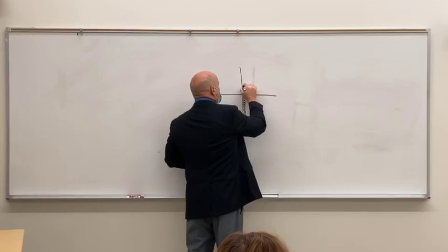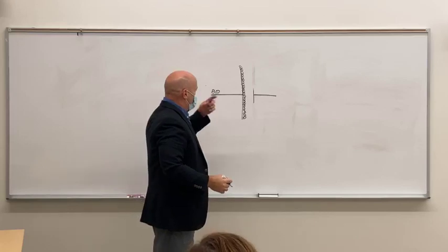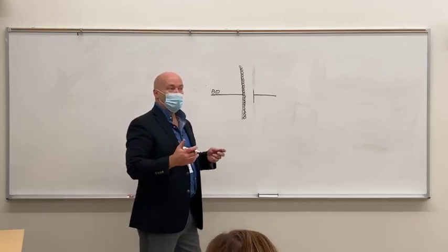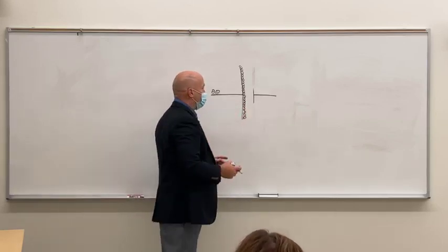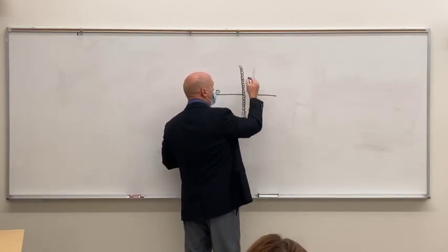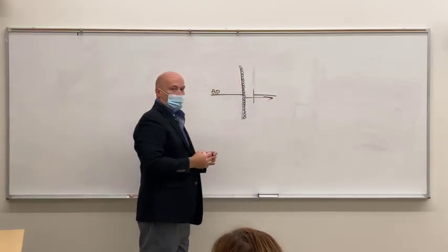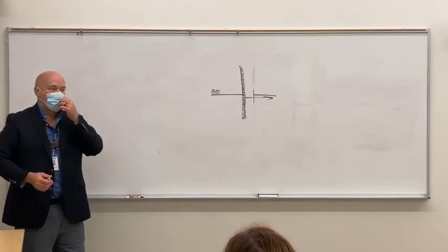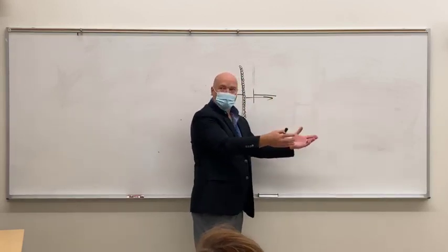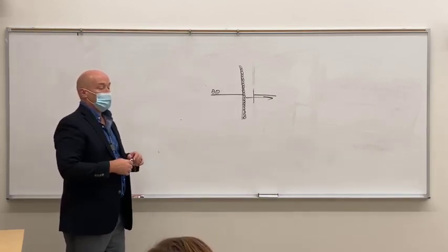The law of electrostatics says that the more electrons you have, the more charge you have, right? So you can store up all these electrons on this one side, and they're not going to flow across. But when you're ready for them to, you can bring these things closer together or do whatever you need to do to break down the insulating factor between the two, and the electrons will jump across. That's a capacitor. So you build up a charge in a capacitor, and when you're ready to use the charge, you discharge it, okay? So some of our X-ray units, some of your older units, work off of that principle.